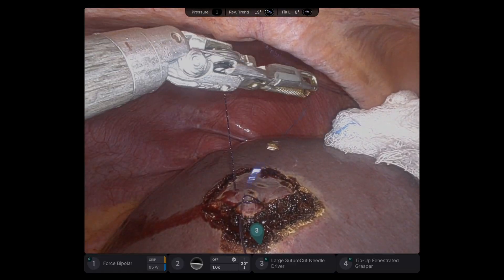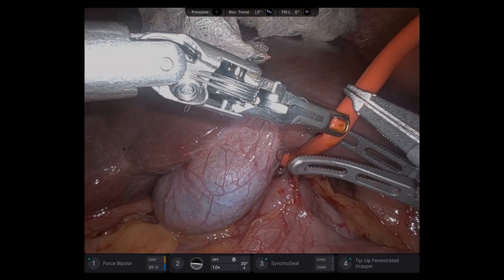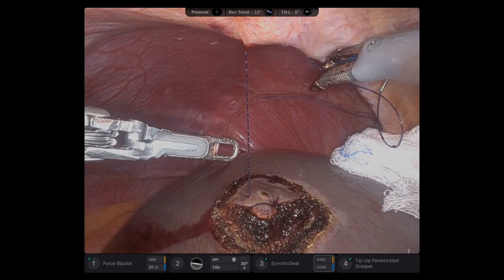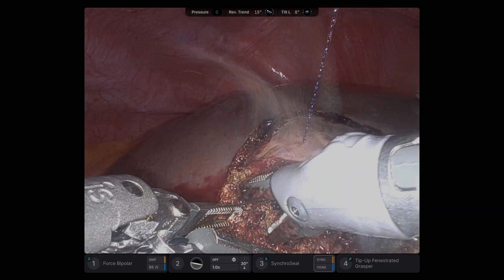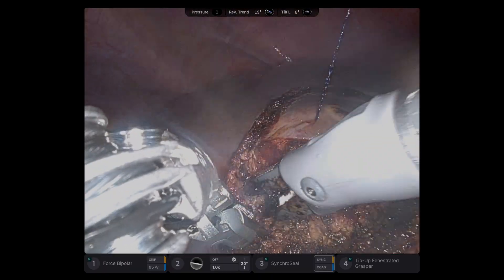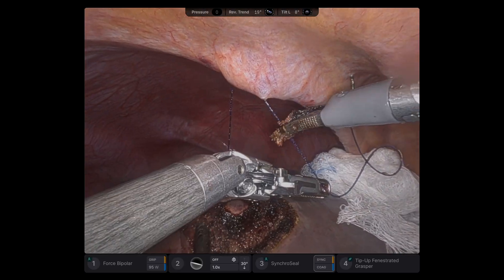You can go twice in the diaphragm, but once was good enough here, and you can see it lifts the specimen. I do Pringle for bloodless dissection, then I start clamp crush technique — small bites, small problems. Try to maintain good margin.